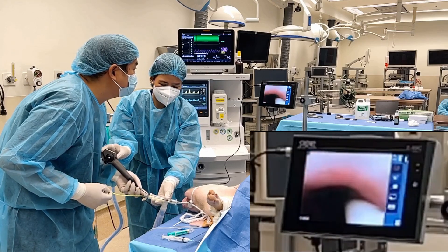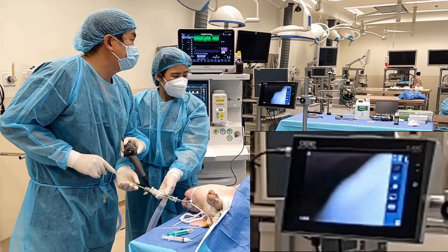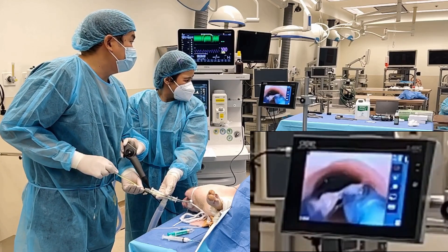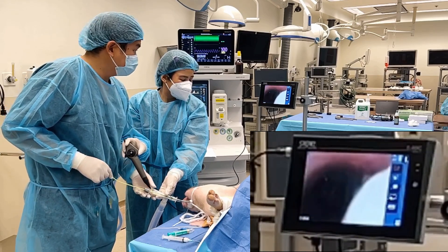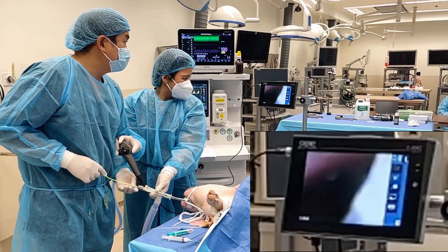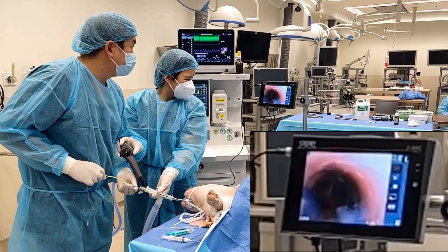Here, both of the tips are lodged inside the right main bronchus. In these cases, pull out the EC blocker and reposition with the guidance of the flexible scope. In some cases it is difficult for the tips to separate. It is advisable to retract the endotracheal tube away from the carina to give room for the EC blocker tips to separate.